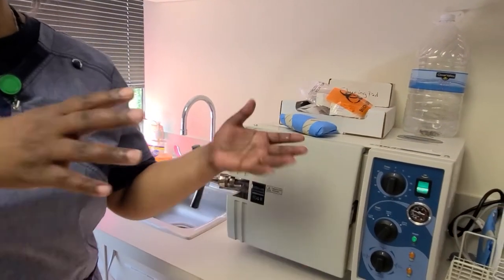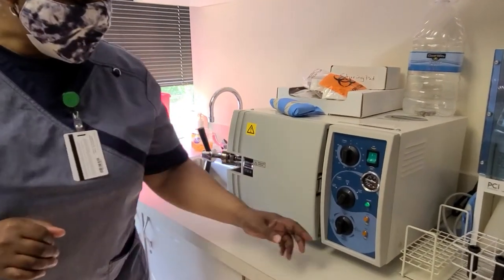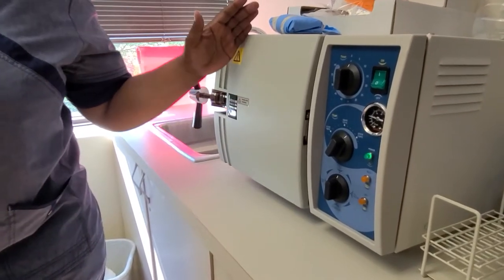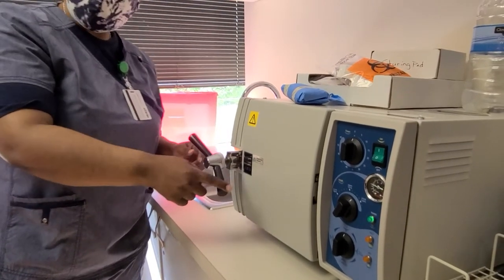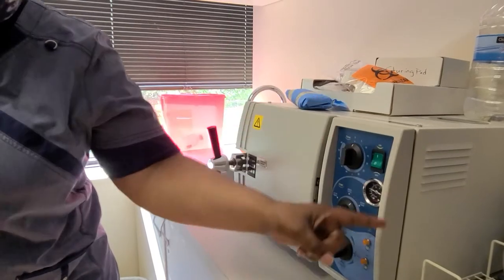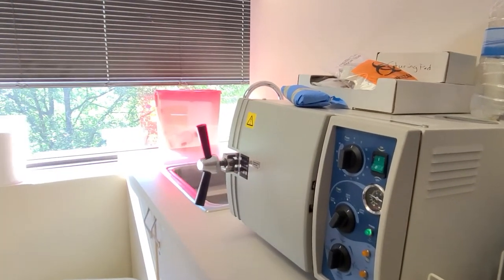Now I'm going to go through this, but I want to show you the end first, though I'm not going to be able to do it because it's going to take 30 minutes or so. After I hit sterilize to stop the water, I place my instruments in, do this, and lock it. Once I lock it, now I go up here, because remember, we're going in this order. So I have 250 to 273 degrees Fahrenheit.